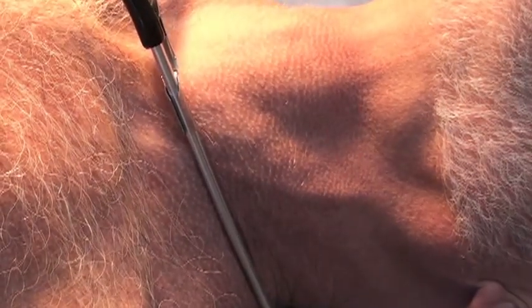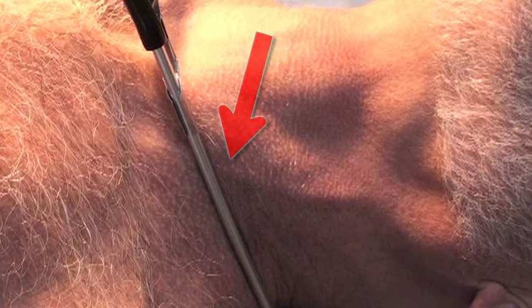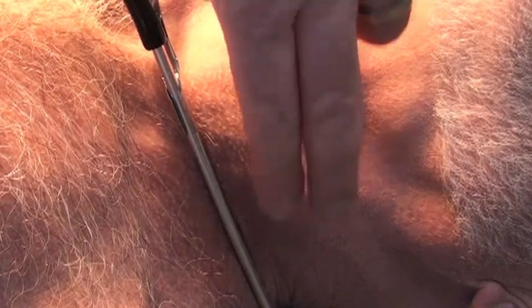Your first goal is to identify the vein. You can make the vein more prominent in a number of ways. First, you can tilt down the head of the bed or raise the patient's legs. You can also have the patient Valsalva or bear down to have the vein bulge out. In some patients, you can even put a stethoscope around their neck — as you can see, it occludes the distal end of the vein, making it more prominent. As with all veins, percussing or smacking the vein makes it stand up a little bit more.